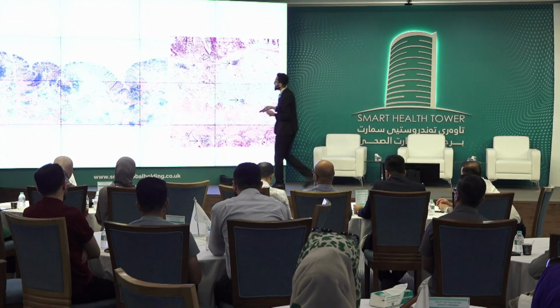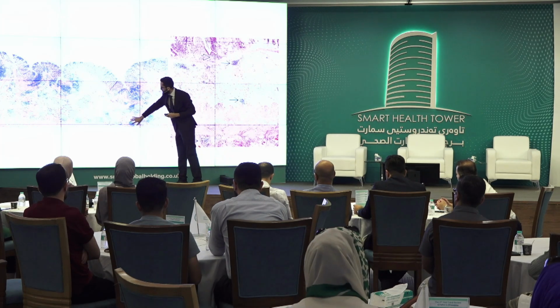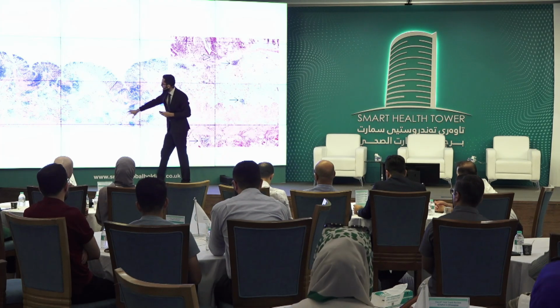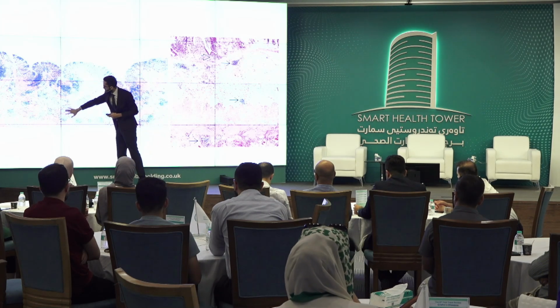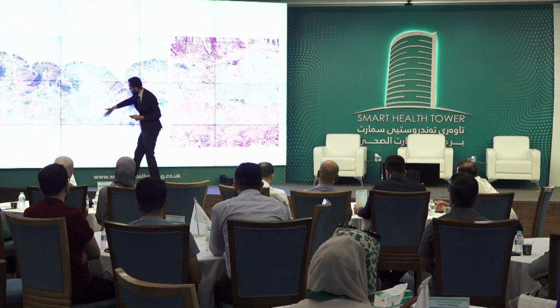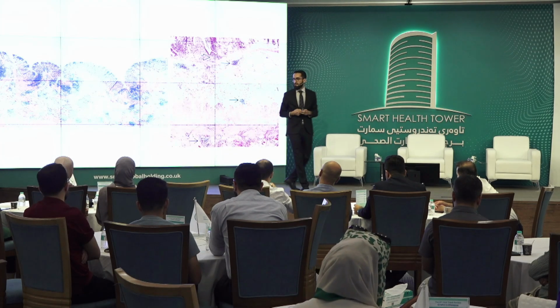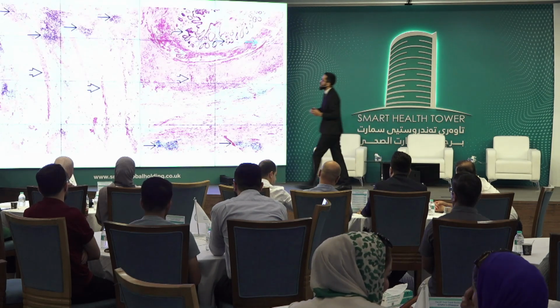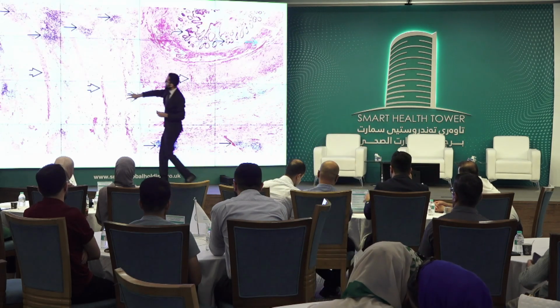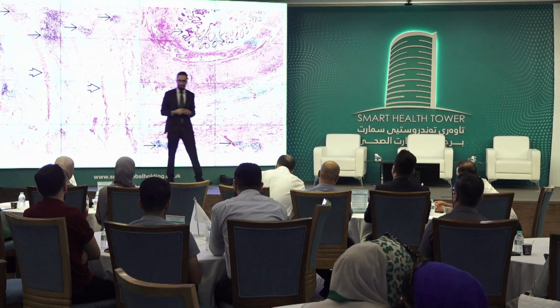One of the other hallmark features of Crohn's disease that we only see in resection specimens are transmural lymphoid infiltrates. So these are lymphoid follicles, and they are found not only in the mucosa, but they also go into the submucosa and into the muscle, and sometimes they're arranged in a linear fashion known as a rosary bead or a string of beads. Okay, so these clear spaces, this is fat. This is the mesenteric fat that creeps along the wall, which we refer to as the creeping fat.